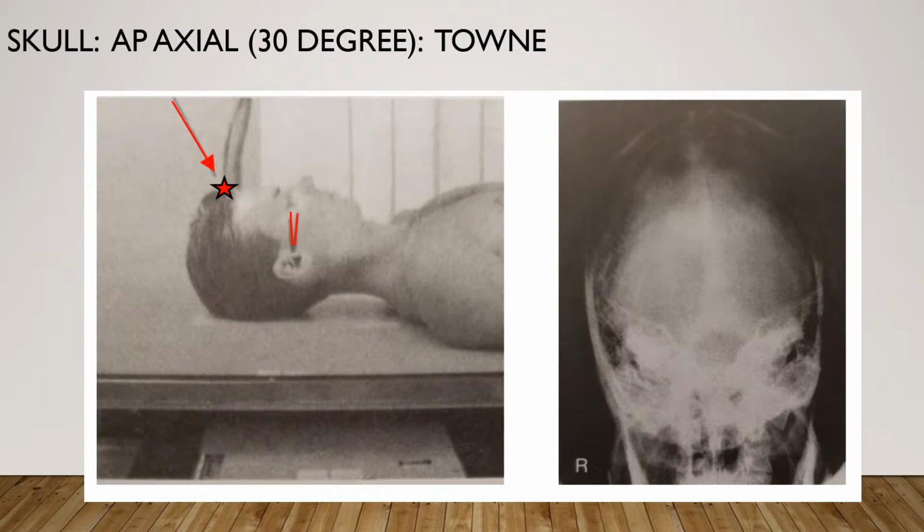When we're looking at our x-ray, we can see the occipital bone, petrous pyramids, and foramen magnum. The dorsum sellae is within the foramen magnum. There's no rotation evident by symmetry of the petrous pyramids of the temporal bone. Optical density and contrast to visualize the occipital bone and structures within the foramen magnum. And we have sharp, bony margins with no motion.